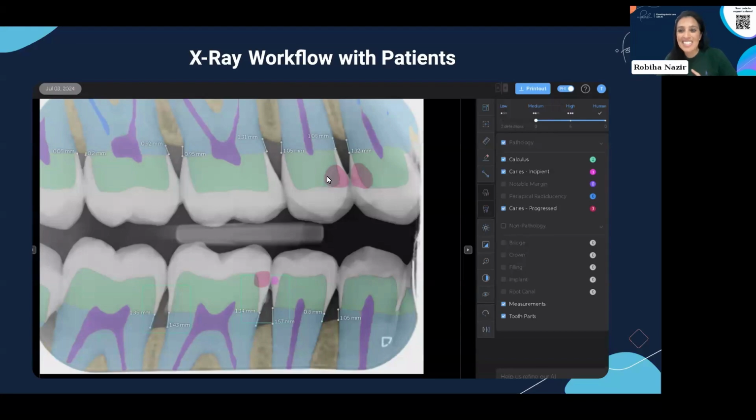One more question. How do you create a PDF document? So it's the printout button. On this screen, if you look to the top right, you've got this blue printout button.